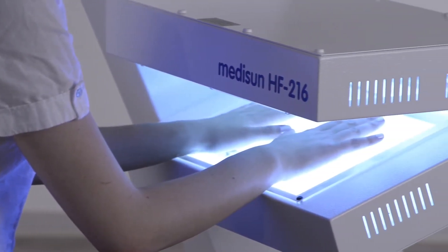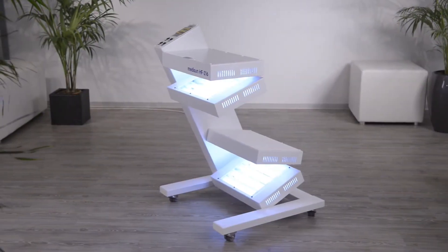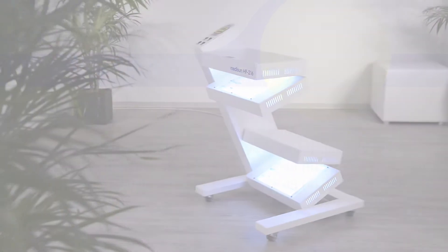If you'd like to know more about the MidiSun HF216 or if you'd like to receive a personal offer, please contact us by email, fax, or phone. Thank you!